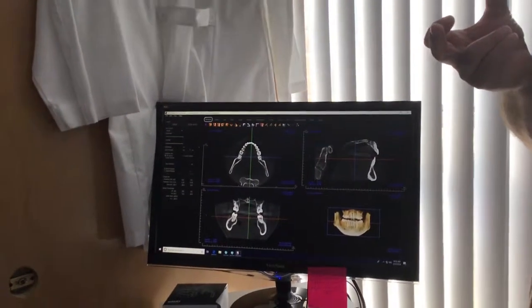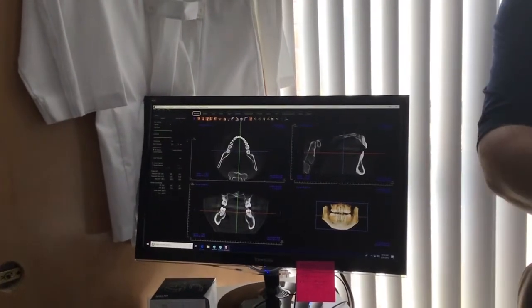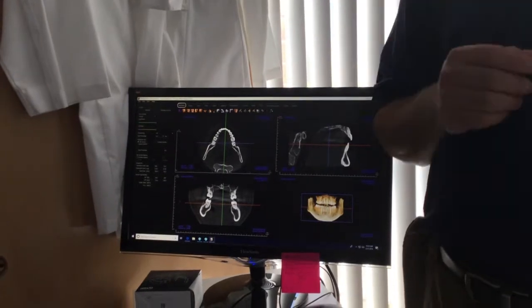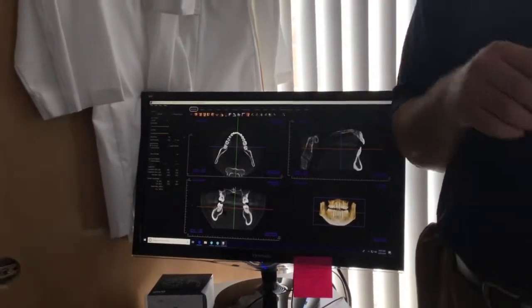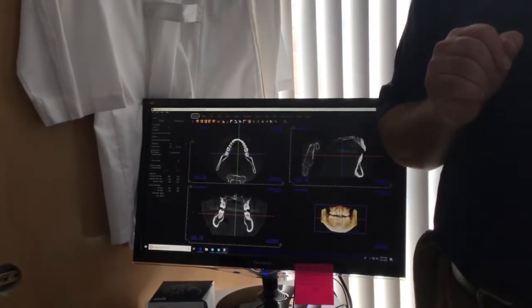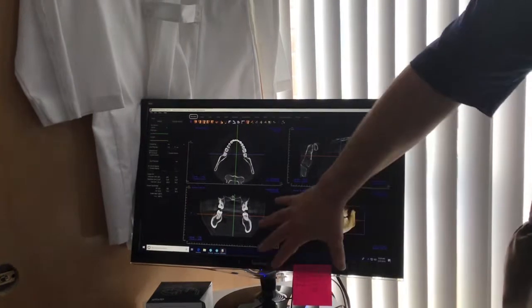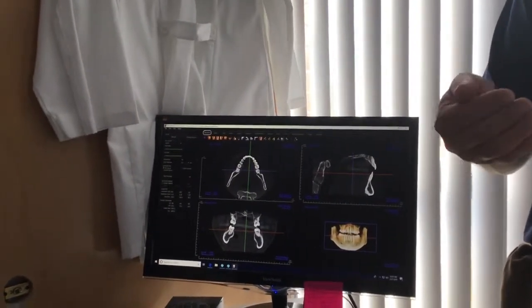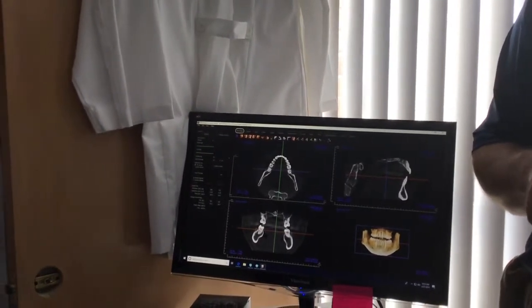So there's the cases CD. They gave you a CD with it that has all the codes on it. It's probably somewhere in this pile. There are 4 codes listed on that. 2 are called network codes. Those live in your office. 2 are called perpetual codes. That means they can go anywhere. One perpetual code is always on this computer. The other one is what you put on a laptop that will work outside your office.